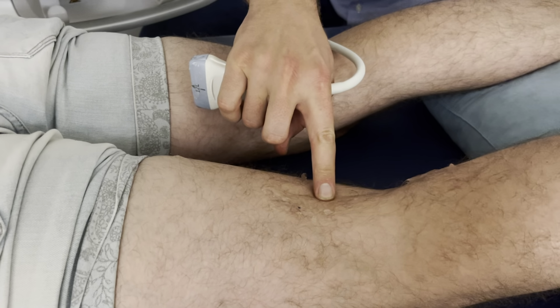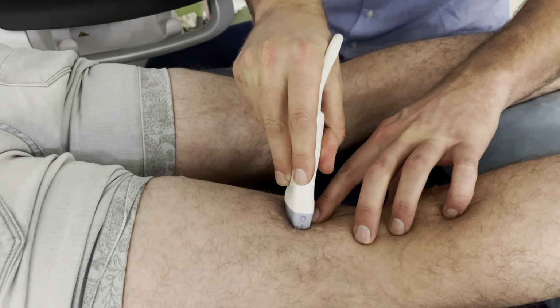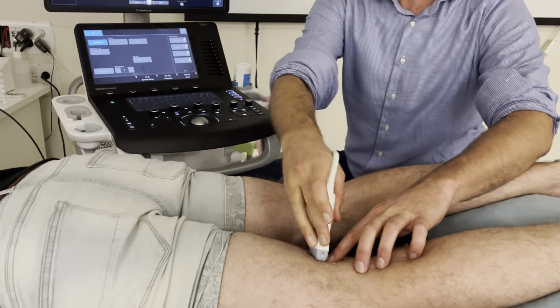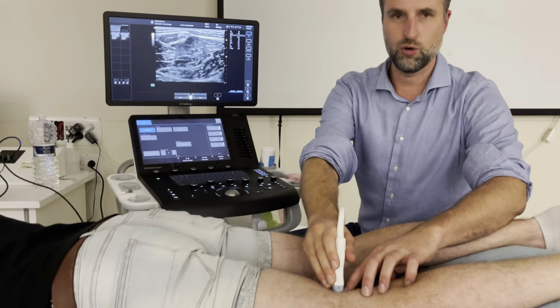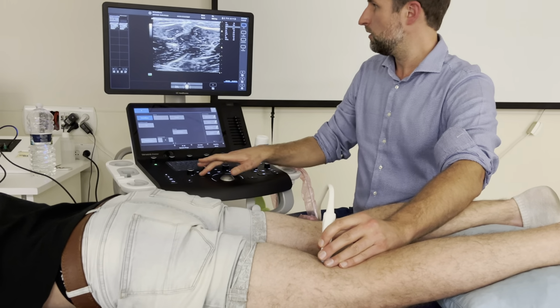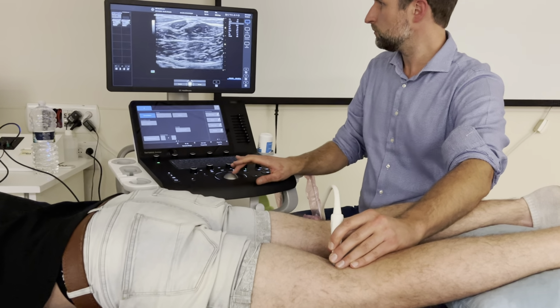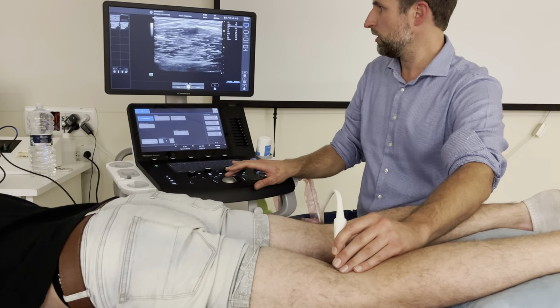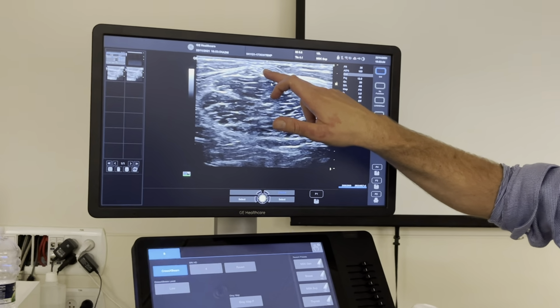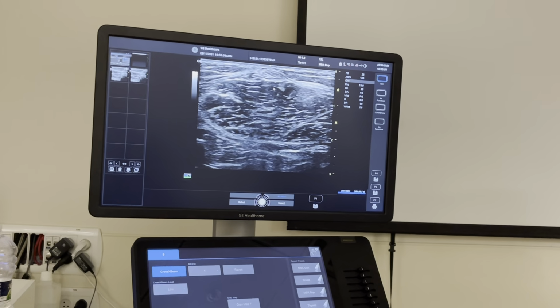So you can relax now, keep my finger on it like this, take my probe, look at the right angle, other way around, exactly. And then I know that exactly in the middle of my probe should be the tendon. There we go. So if I scan here, I see here it's very superficial, a very nice tendon, and beneath it I see a very big muscle belly. And the tendon here is the semitendinosus. This big muscle belly beneath it is the semimembranosus.